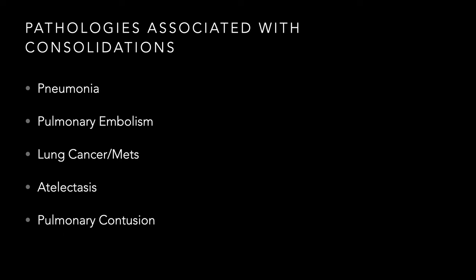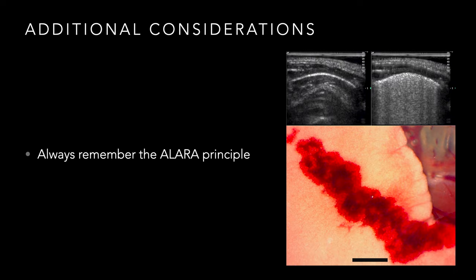So with that said, I want to wrap things up. We're going to go a little short today, but we want to wrap up with a few additional considerations as you're scanning lungs. The first one is to always remember the ALARA principle. For a reminder, the ALARA principle is the as low as reasonably achievable principle.